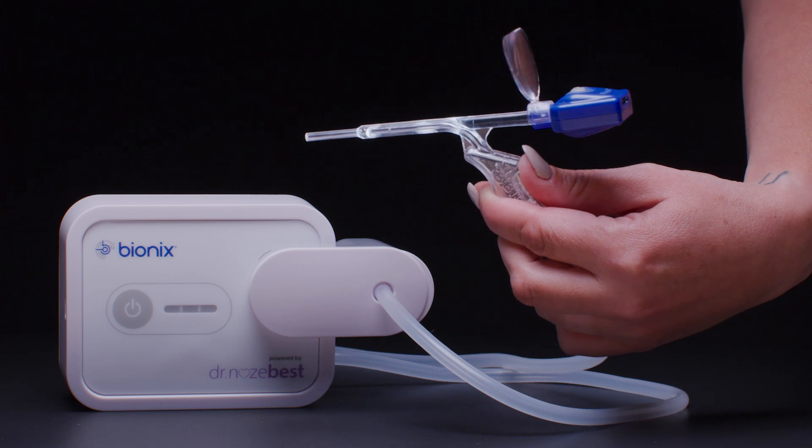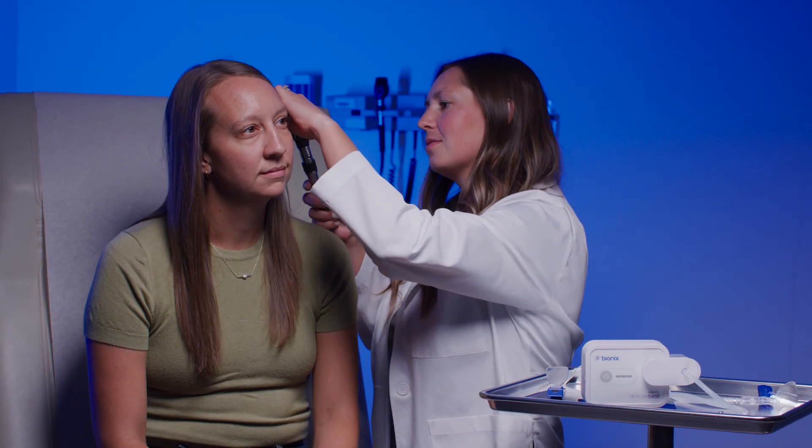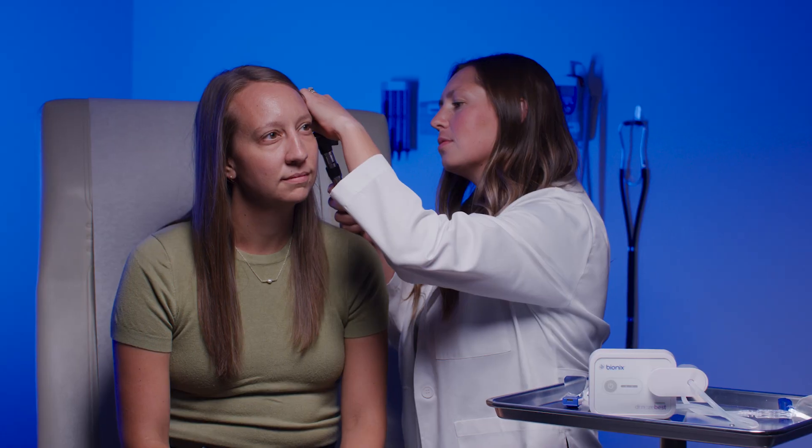Once connected, you're ready to begin. Examine the ear or nasal passage with an otoscope to locate the obstruction.